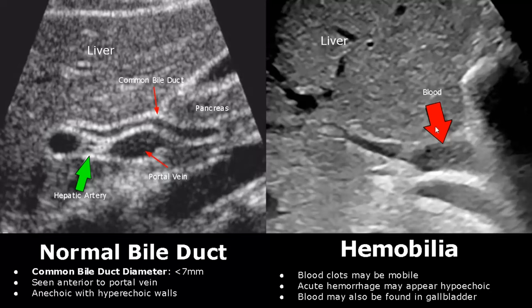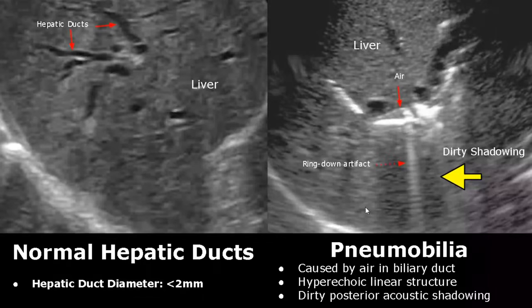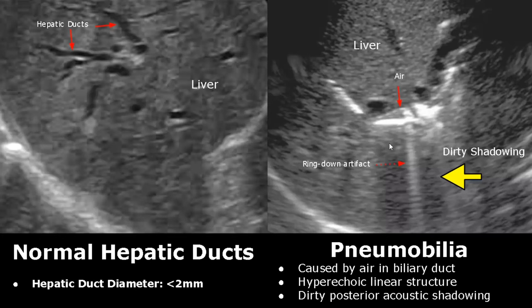Blood may also be seen in the gallbladder. In pneumobilia, air is found in the bile ducts. It is seen as hyperechoic linear structures with posterior dirty shadowing. You will see a grayish shadow along with a ring-down artifact.